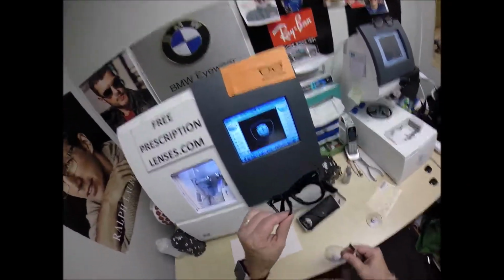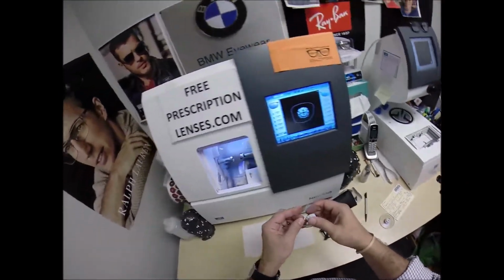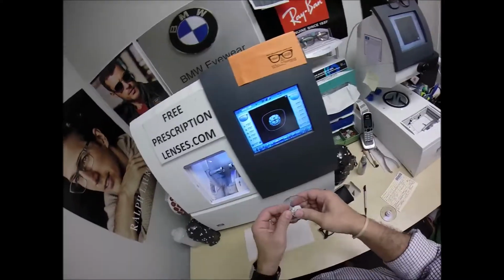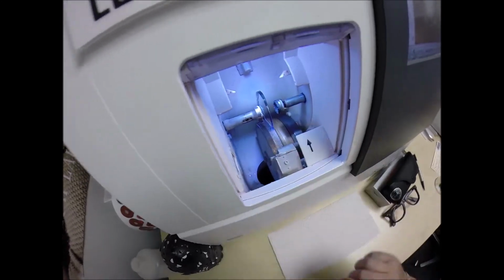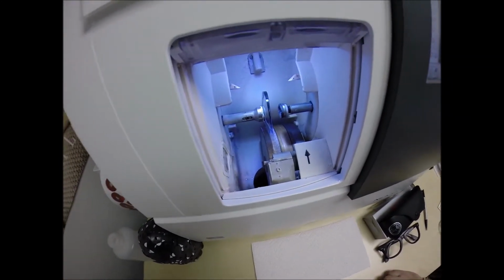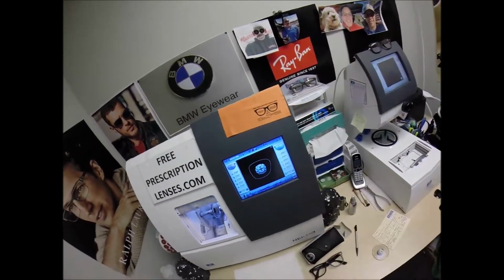I do want to go ahead and take this down 0.25, a quarter millimeter, because the 2140 has a deep bevel, but I'm probably going to have to take it down to 50 or 75 before it fits. I'm going to press that sticker on there firmly, place the magnet into the chuck. That's going to do its job its second time.